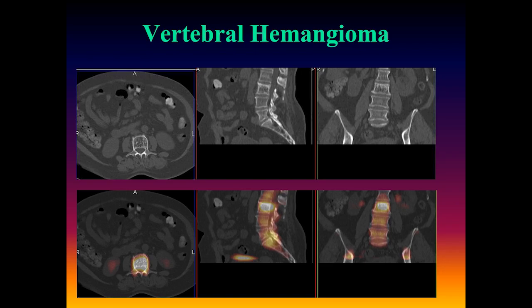It goes without saying that the more sophisticated the CT component of your SPECT CT or even your PET CT system is, the more diagnostic conclusions you will be able to form.